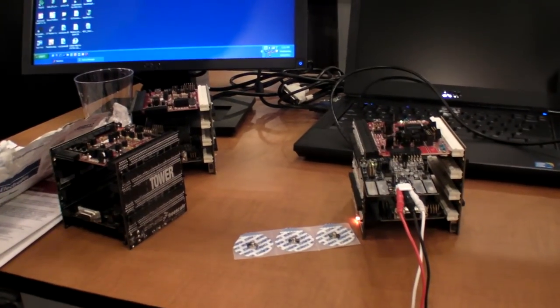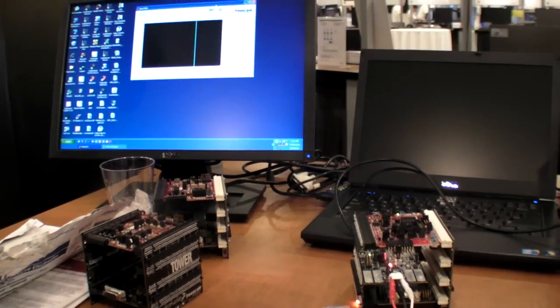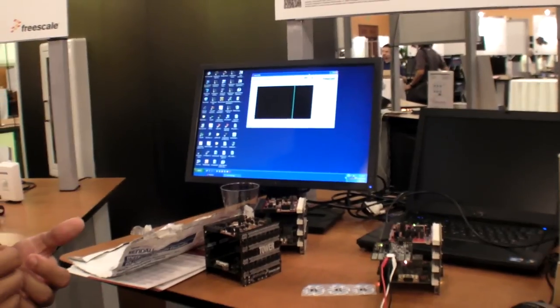It has an integrated analog front end with two 16-bit ADCs, two operational amplifiers, two trans-impedance amplifiers, as well as some DACs. So basically a lot of integrated analog specifically for home portable medical devices.